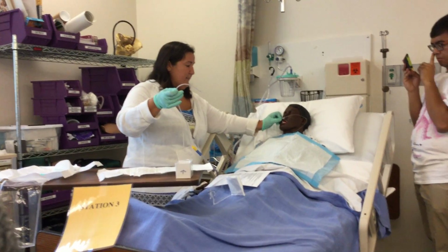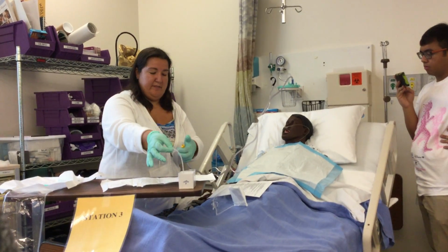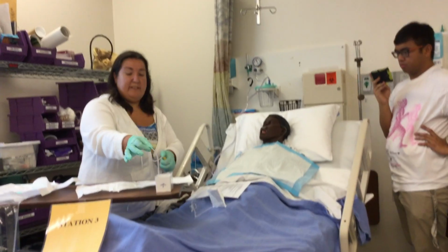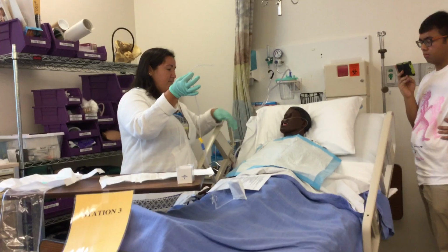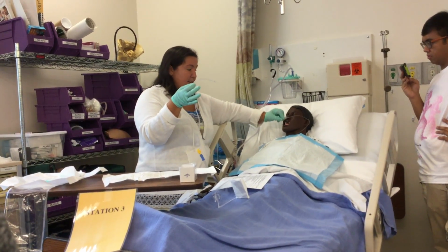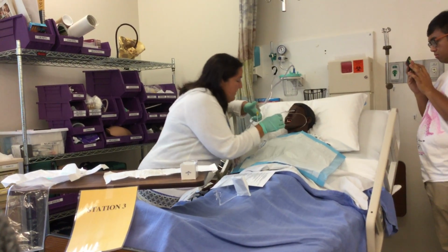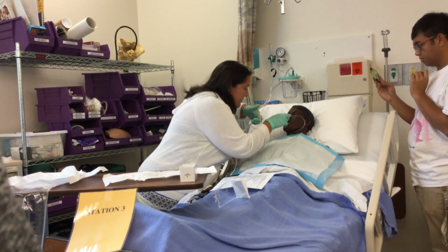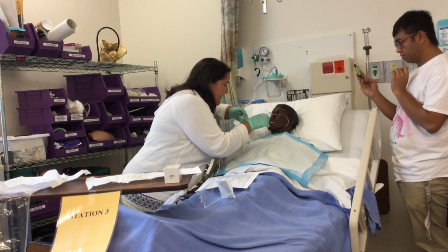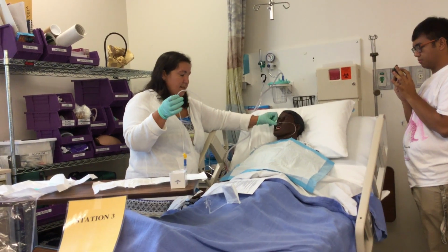Let them take a few deep breaths. Clear it because there'll be a bunch of gooky, yellow, gross colored stuff in here. So you want to clear that out so it's nice and clean. And you're cleaning the end if there's anything on it. Then again, you want to just give them a little time to recover. You're going to let them know what you're doing. Have them take a few deep breaths. And then you want to go back in. Put it in there. You want to keep your finger off while you're putting it in there. And then you put their oxygen back on. Give them a little break.